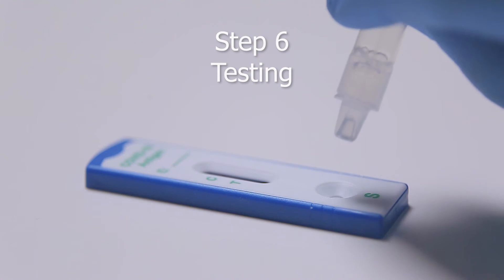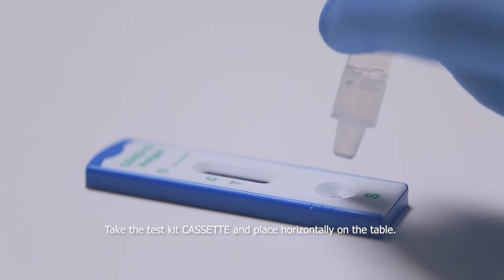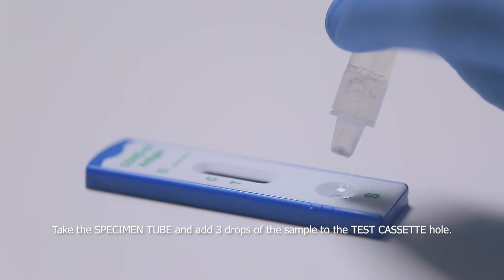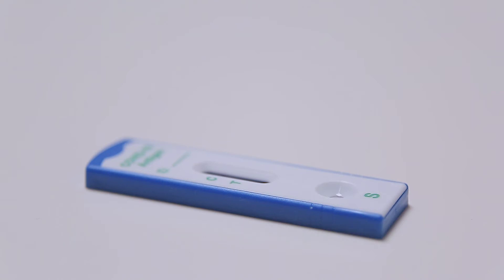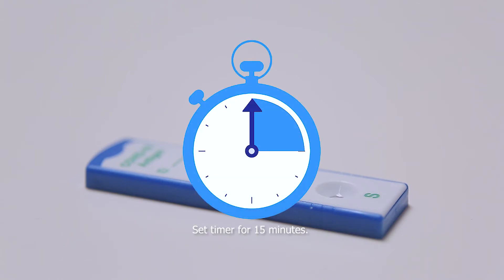Step 6. Testing. Take the test kit cassette and place horizontally on the table. Take the specimen tube and add three drops of the sample to the test cassette hole. Set the timer for 15 minutes.